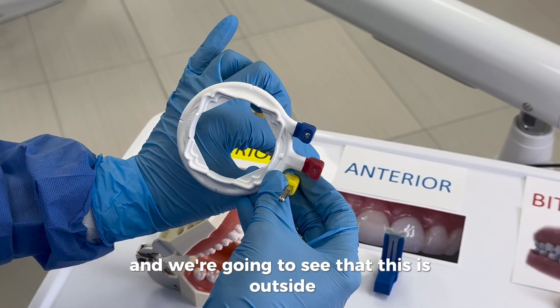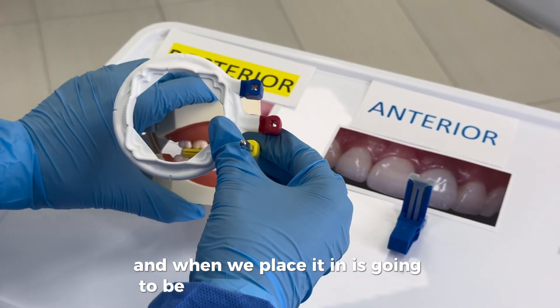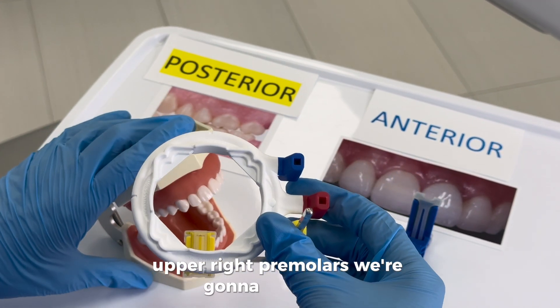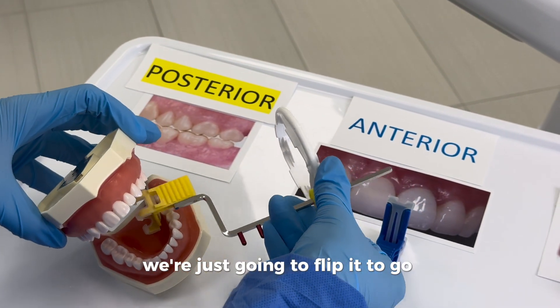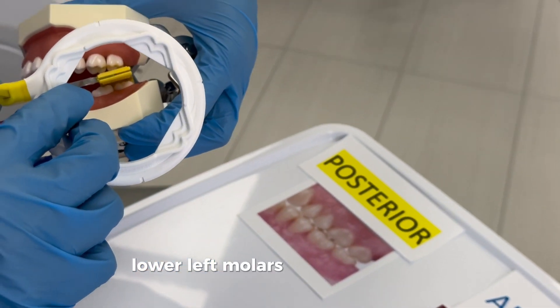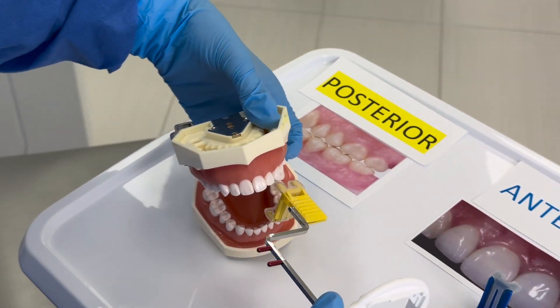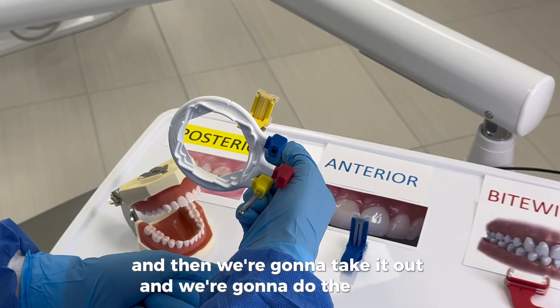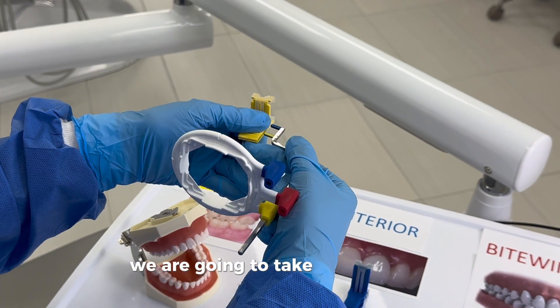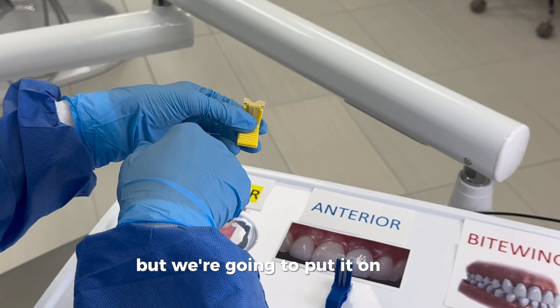We check it with the mouth and we can see this is outside. When we place it in, it's going to be for the upper right molars — upper right three molars. We take it out, flip it down for the lower left molars and then lower left premolars. Then we take it out and do the change — we move the arm from this side to the other side, and now it's upper left.